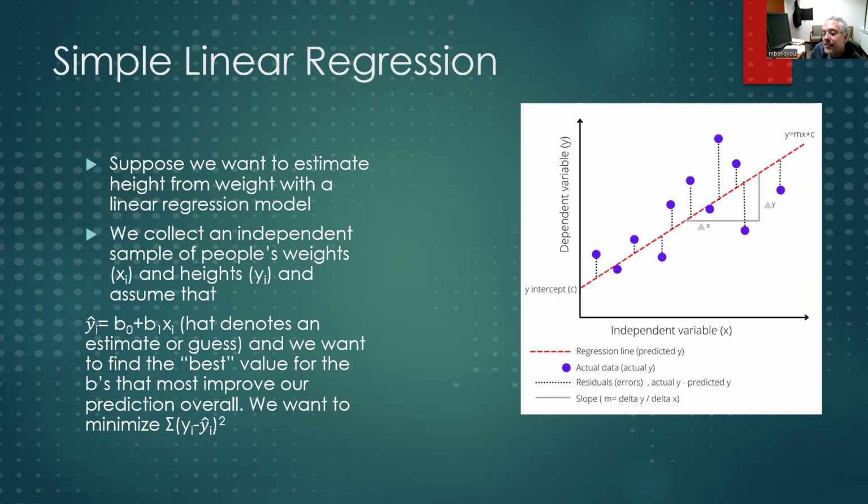And then the question is, if we don't get exactly 0, but a number close to 0, how statistically confident are we that that's just within measurement error? Is that really not 0? Is it really related or not? And so I want to start with a simple example in math, which is a simple linear regression. And then we'll turn back to the slightly more complex fMRI experiment math. But you'll see there's a lot of similarity here.